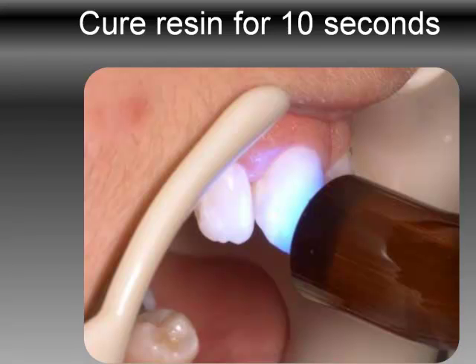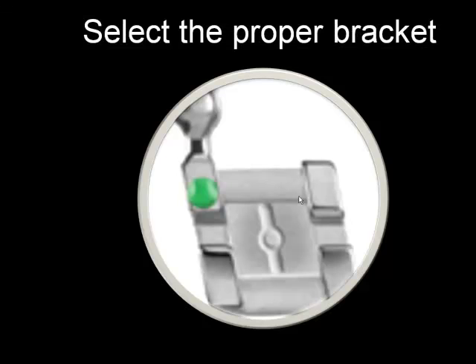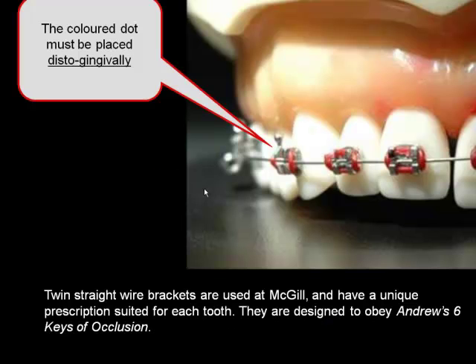Again, you have a very light coat of resin and cure for 10 seconds. Make sure you select the proper bracket — it happens occasionally that your system places the bracket in the wrong slot. Always verify that the slot is distal-gingival. This happens to be a canine bracket; here's a different canine bracket from a different brand, but the slot is distal-gingival, and you have to bracket the teeth as well as possible.